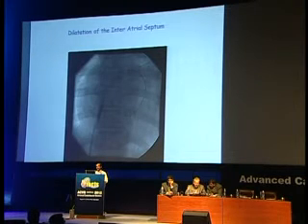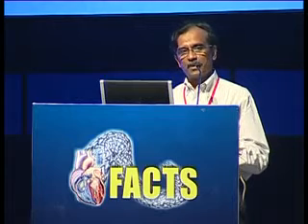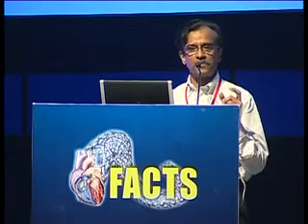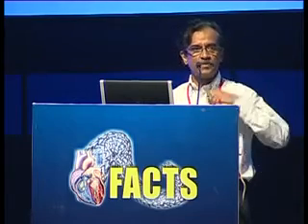So this technique of dilatation of the septum with the PTCA balloon will help you in overcoming the resistance at the septal level. Now, once you cross the interatrial septum and maneuver the balloon into the left atrium, the most important thing is that the initial placement of the catheter should be as deep as possible, and see that the tip of the balloon is around 7 o'clock in the frontal plane.